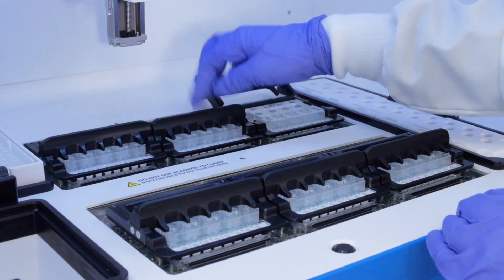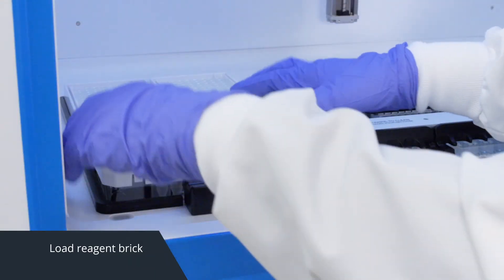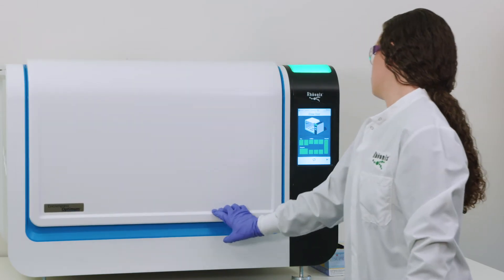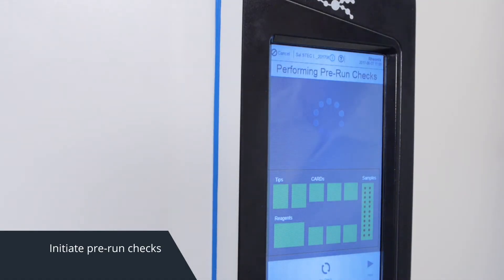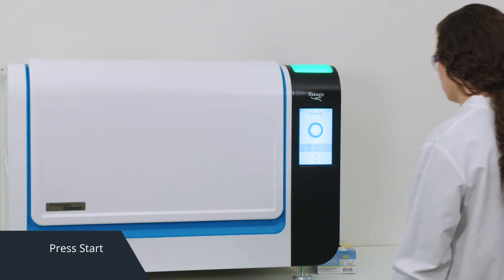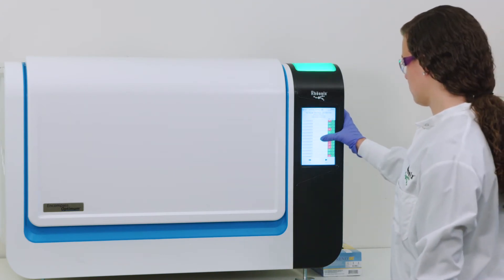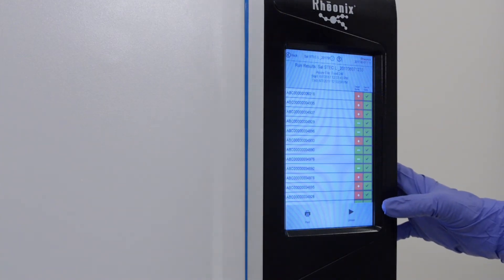Load three or six card cartridges into the modules — each cartridge processes up to four samples. Load the reagent brick and close the door. The workstation will do a short pre-run check to ensure components are properly loaded. Then simply press start and walk away. It's that simple. When the run is finished, view results directly on the workstation or upload for later review.